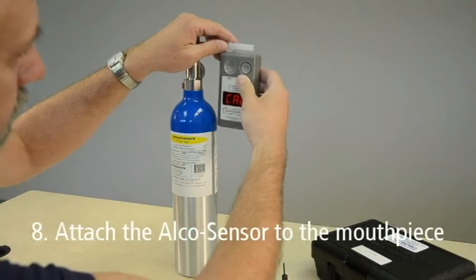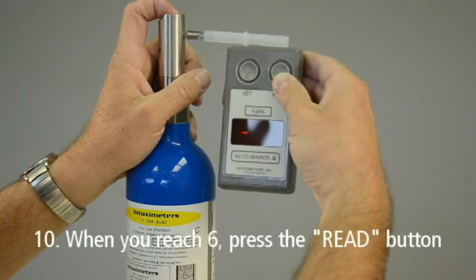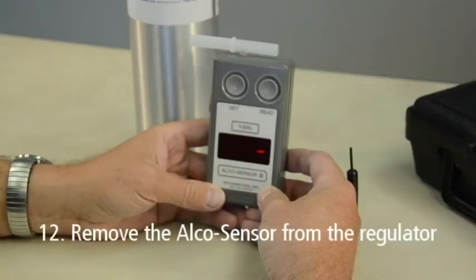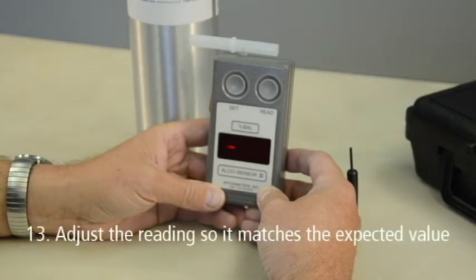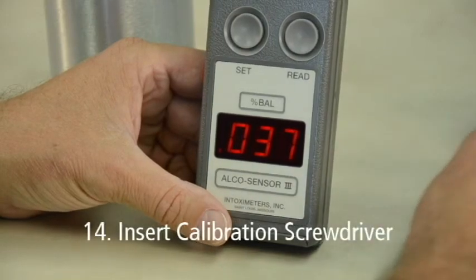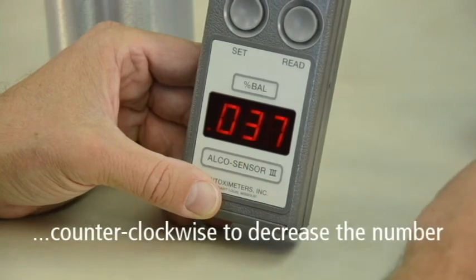Carefully attach the AlcoSensor to the mouthpiece on the regulator. Next, press and hold the regulator button and count to 7. When you reach the count of 6, press the read button. On the count of 7, release the regulator button. Gas must be flowing through the mouthpiece when the read button is pressed. Remove the AlcoSensor 3 and mouthpiece from the regulator. When the result displays, adjust the reading so it matches the expected value. You do this by inserting the calibration screwdriver into the small hole on the right side of the instrument, turning clockwise to increase the number or counterclockwise to decrease the number to match the value.